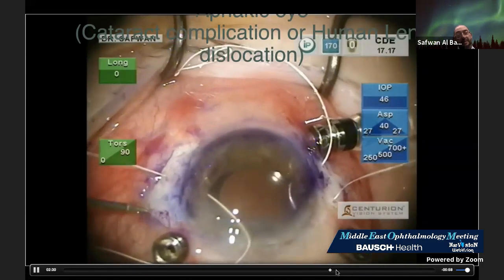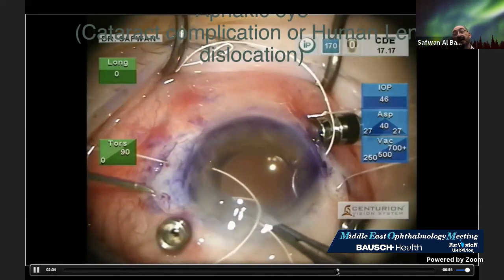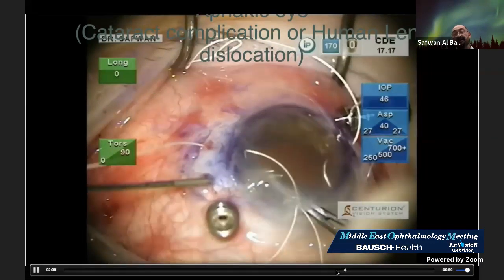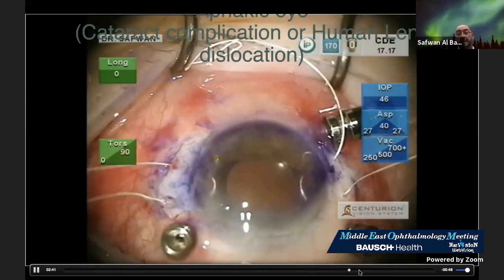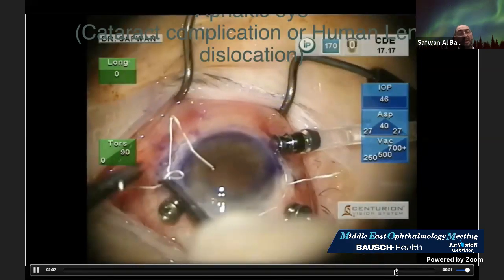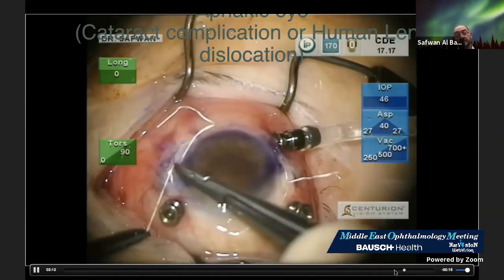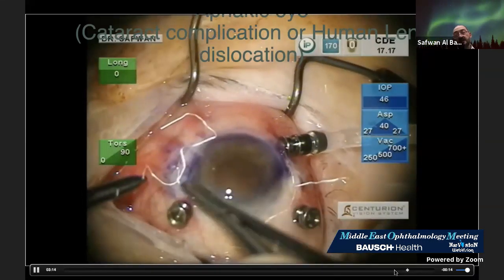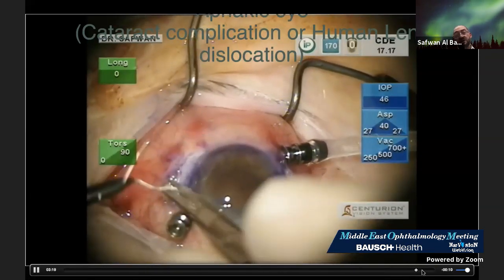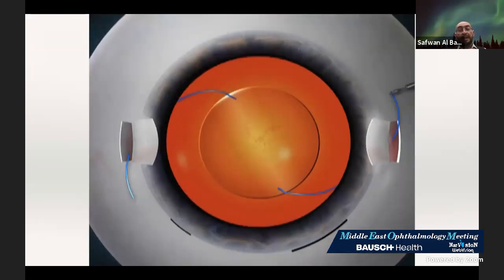Here, grasping the second tip through, see, by right hand, I can prepare the eyelids for the left hand forceps and grasping the suture outside, and then we will end up with the suturing of two ends, 1, 2, 3, tie knots, and then trimming the suture and burying the suture, and then close the conjunctiva.